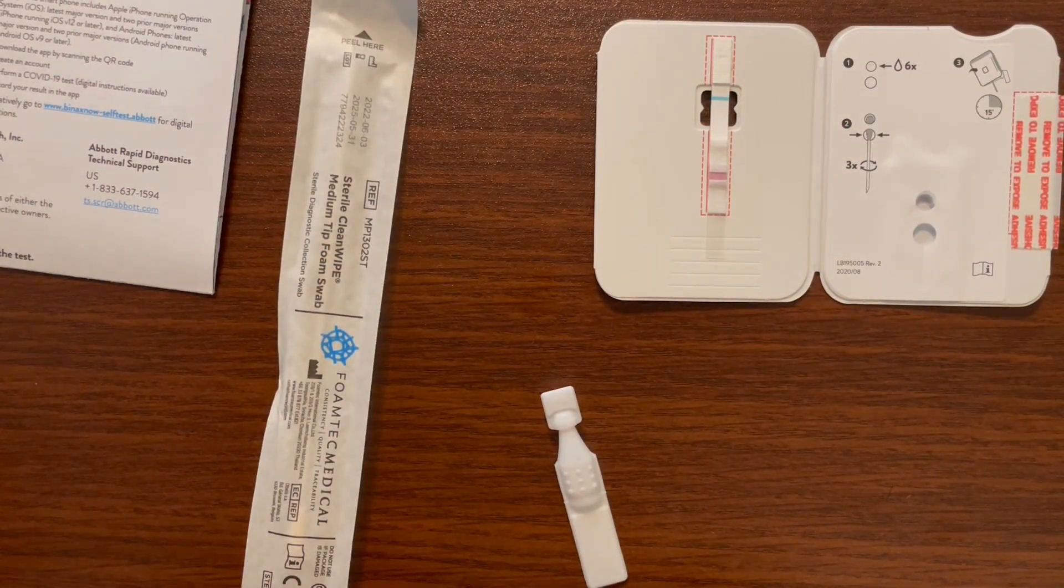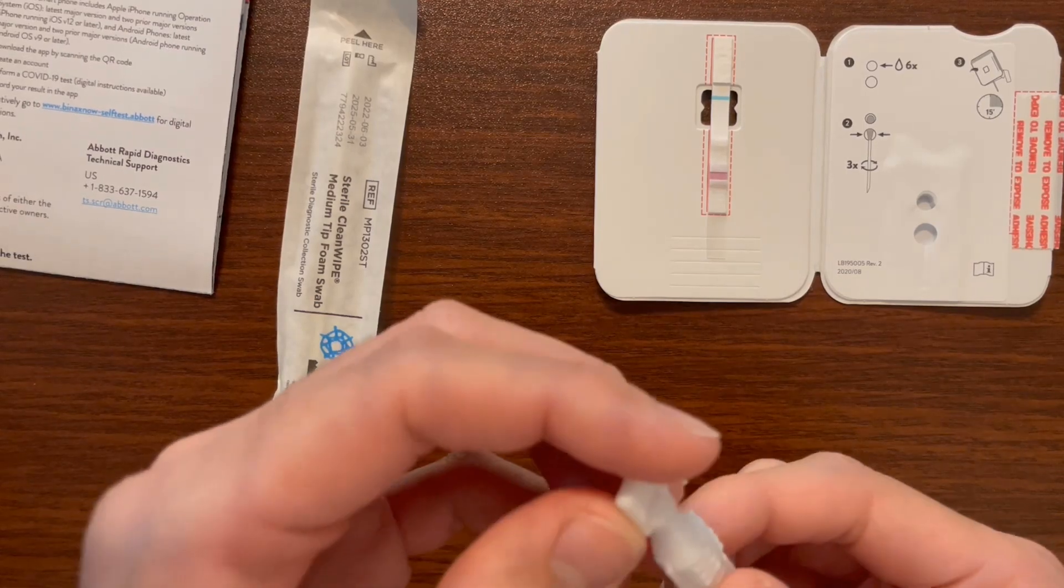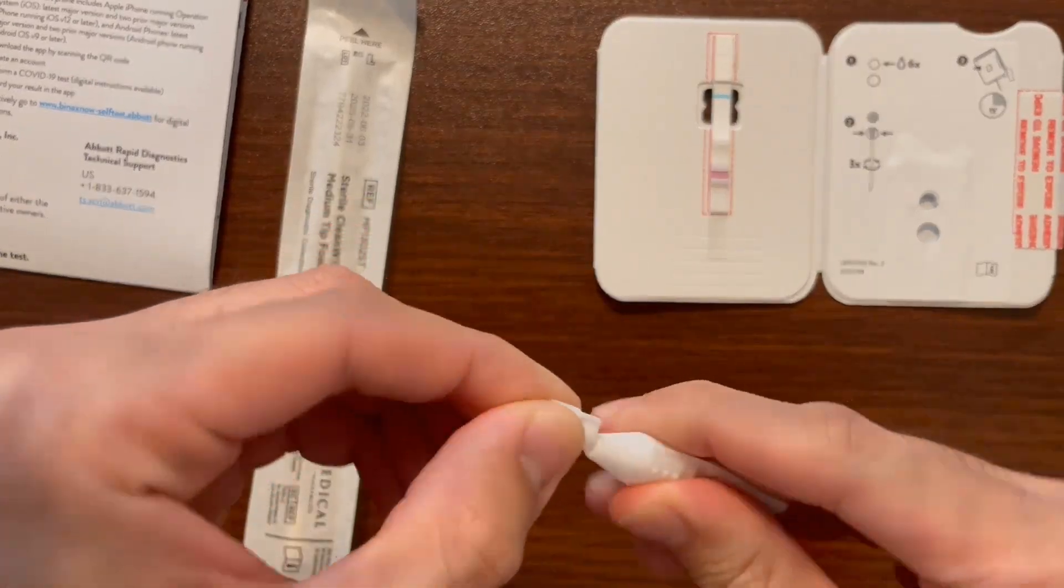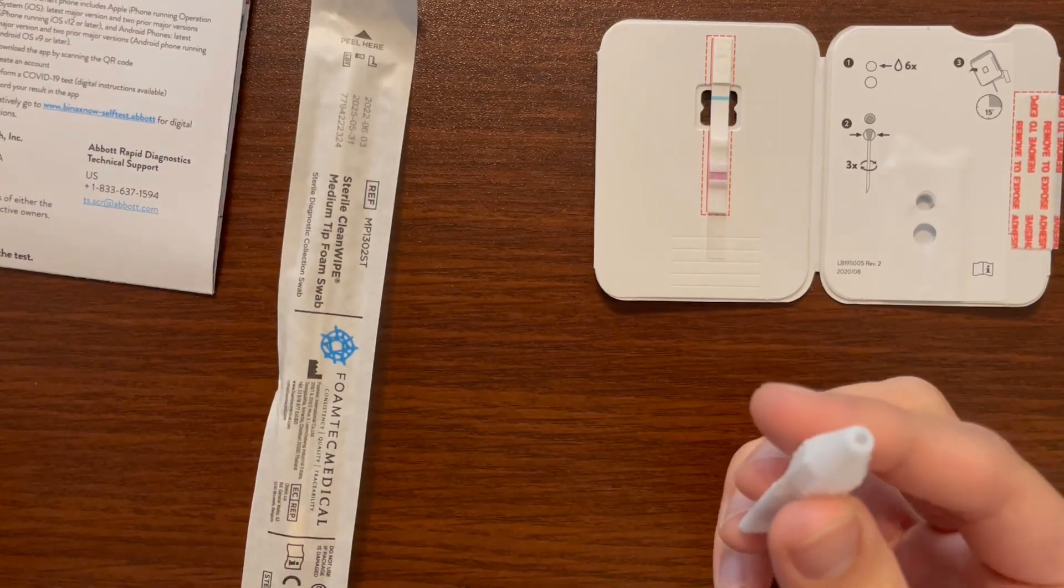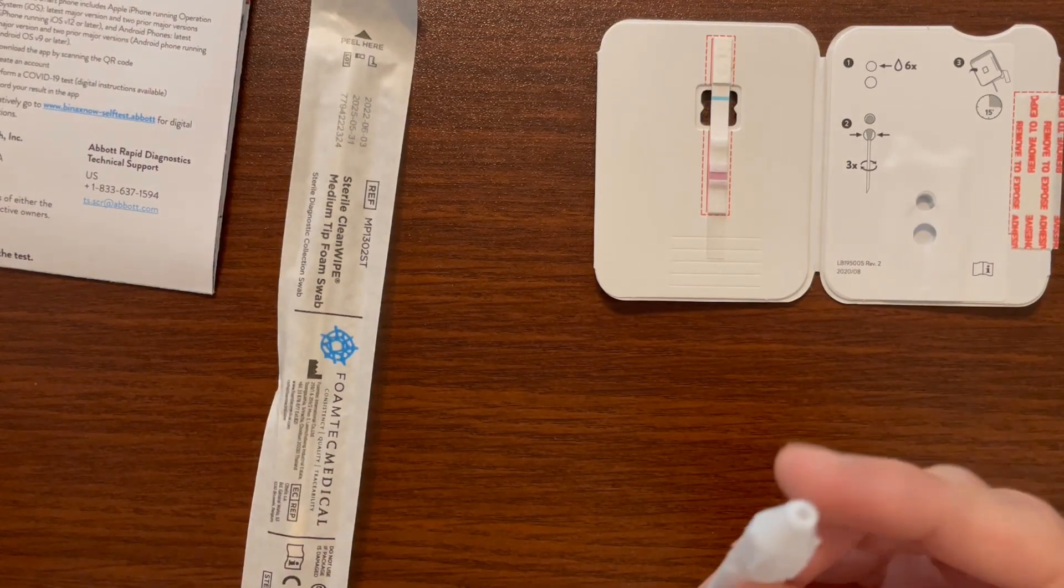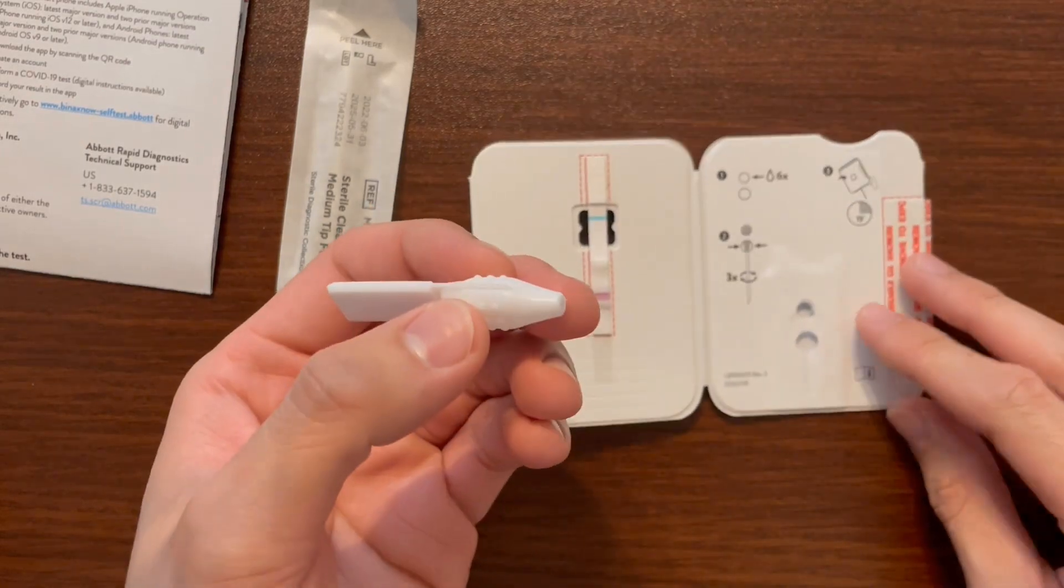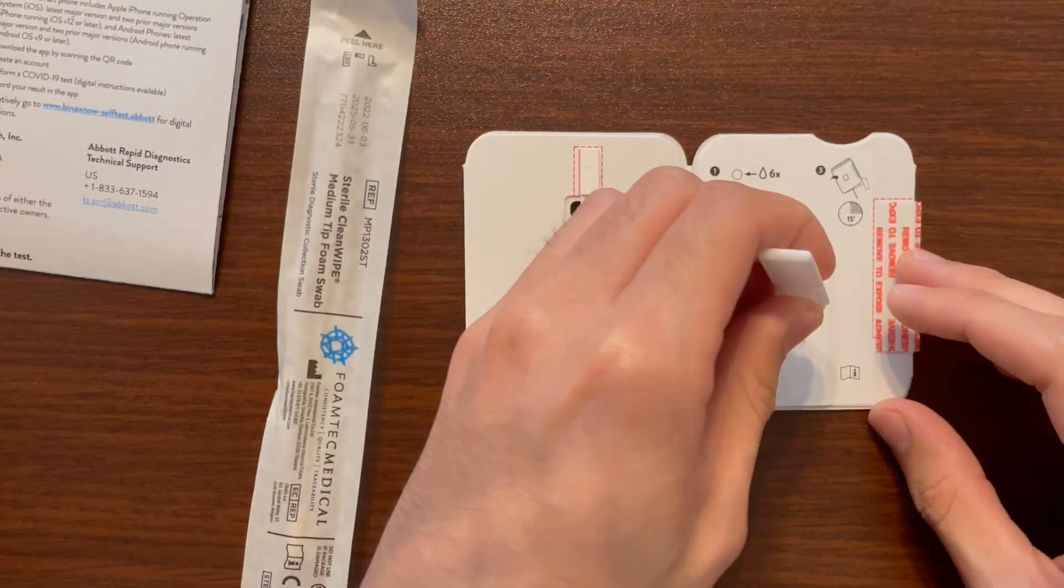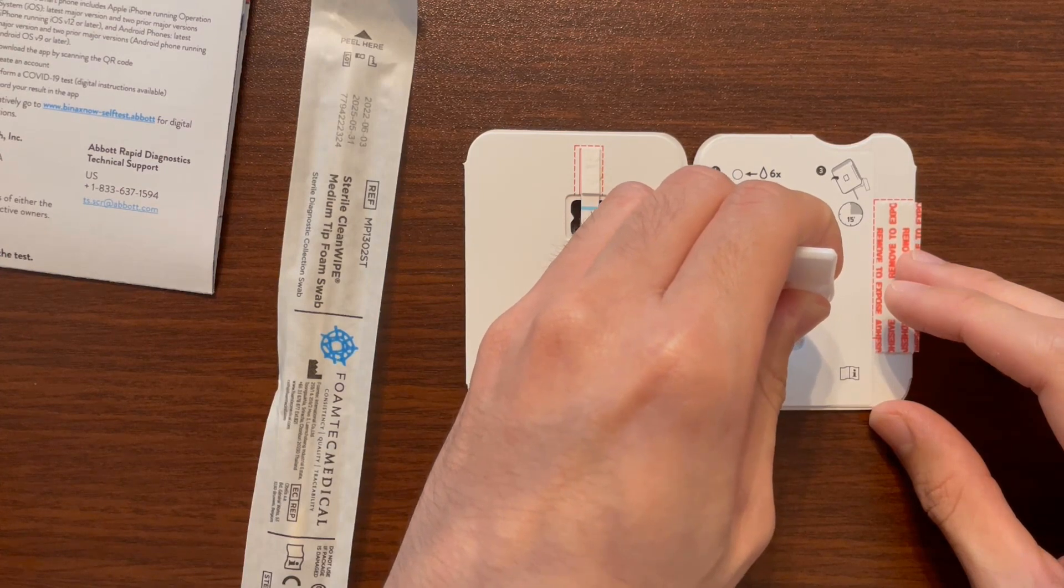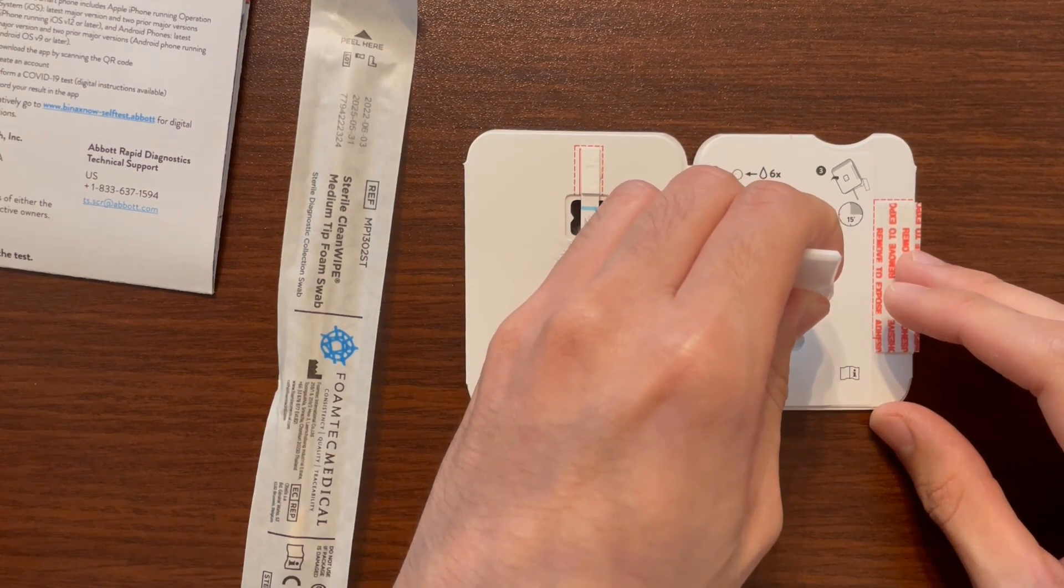Now we're going to take our dropper bottle, just twist the top off like this, and that's how you open the dropper bottle. Then we're going to drop six drops into this top hole. One, two, three, four, five, six.